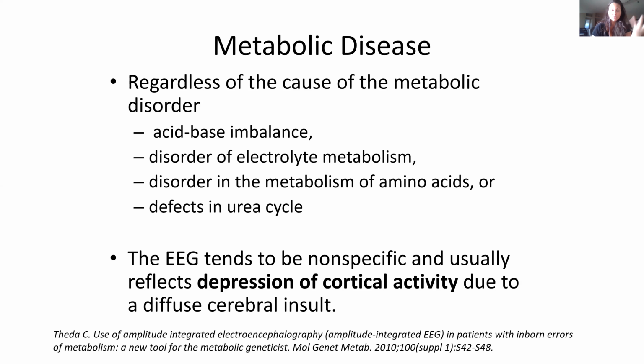But what she's found, so long story to get to the basic point, is that regardless of the cause of metabolic disorder, so whether it's acid base, whether it's electrolyte, whether it's amino acids, or just urea cycle problems, it didn't really matter what the cause was. It almost always caused a non-specific depression in cortical activity. And this was really a reflection, and makes perfect sense, right, of a diffuse cerebral injury.